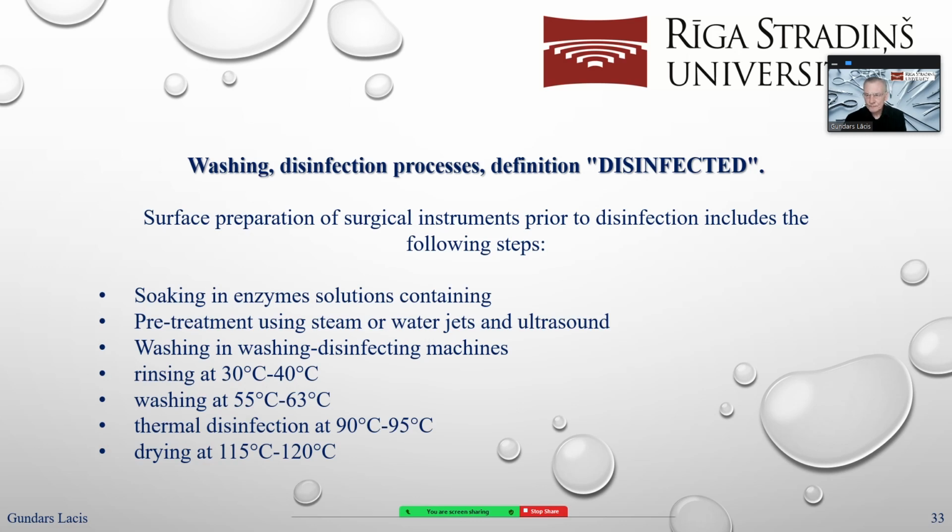But for high-risk medical devices subgroup C, washing only at 55, not more, and disinfection also only at 55, not more. But in those cases, disinfection is chemical, by chemical active agents.